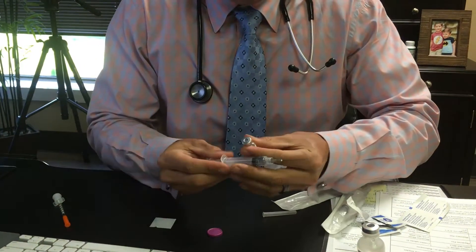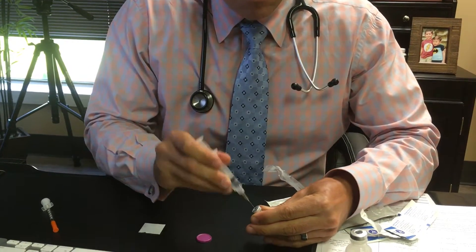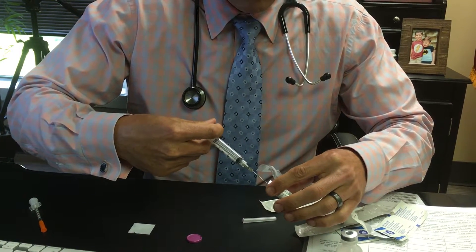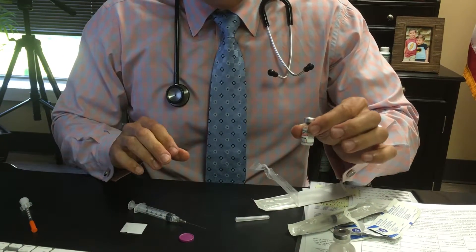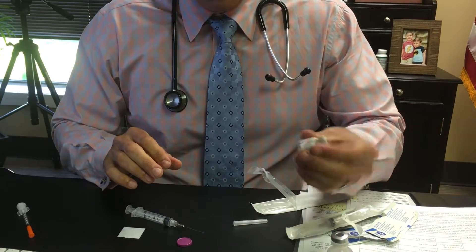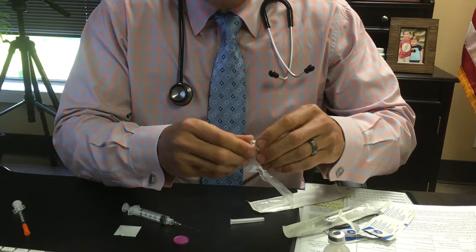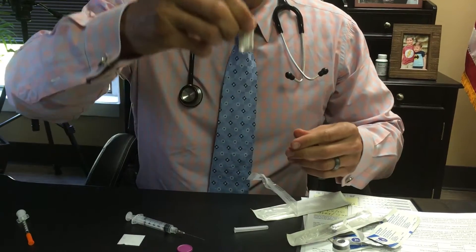Take your Omnitrope vial, stick the needle right in the center, and shoot that water directly into the Omnitrope vial. The key is you don't want to shake the vial — just roll it back and forth in your fingers. You can turn it upside down, tumble it, or roll it just like this, and now you can see that it is reconstituted and mixed.